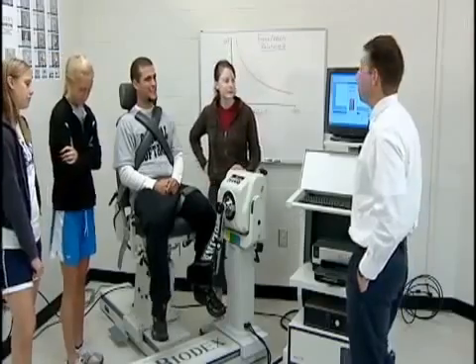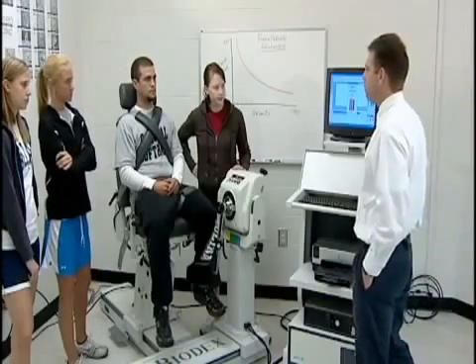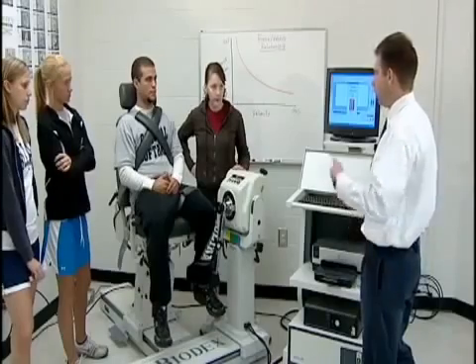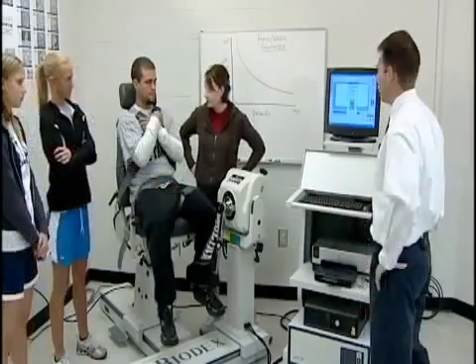The next speed is going to be 120 degrees per second — twice as fast as the first set. Overall, what would his peak torque values be compared to 60 degrees per second? They should be significantly lower, even though he's still giving maximum effort, because of the force-velocity relationship.